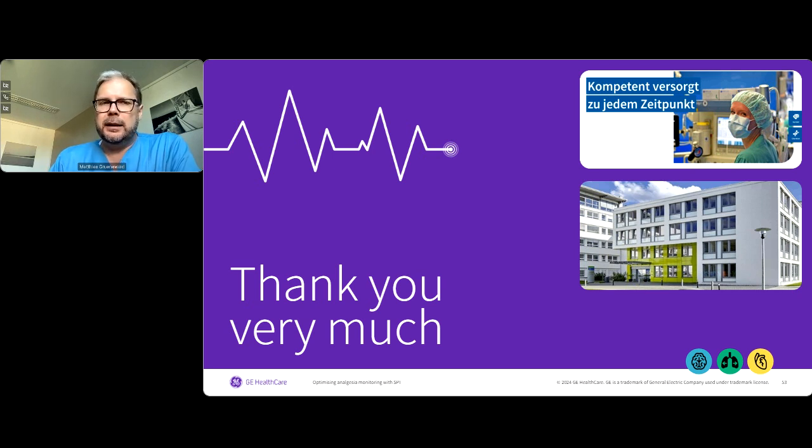I think the word boost is really the right word here. The signal has been prepared for you to see the effect of the nociceptive component, but the one who asked the question is correct. The SPI value reflects the cardiovascular response to a stimulation. So it is always a reaction to something.